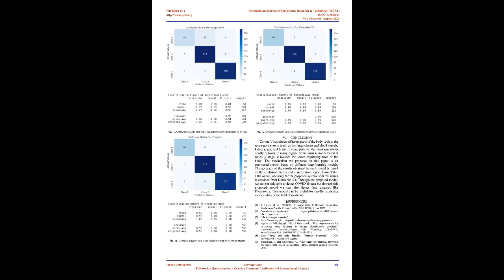5. DenseNet 121. The densely connected convolutional network, DenseNet, has a convolutional neural network architecture that is state-of-the-art according to the classification results with the ImageNet validation dataset. Huang et al. used a direct connection from each layer to every other layer in a feed-forward direction. Each layer in the network receives the concatenation of the feature maps produced in the previous layers as inputs and implements nonlinear functions such as batch normalization, ReLU, and convolution or pooling. After the nonlinear function operation, the product feature maps of each layer are used as inputs to every later layer. The concatenation operation is not effective when the size of the feature maps varies, thus the pooling operation is important for changing the size of the feature maps.